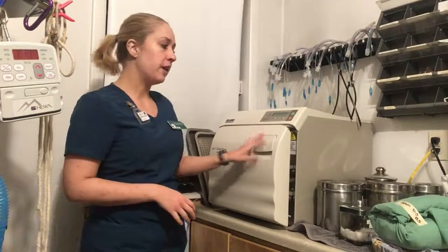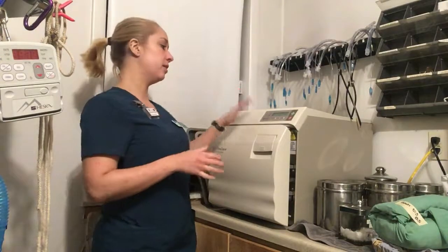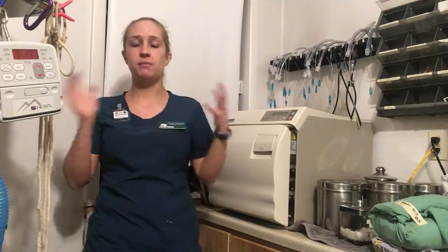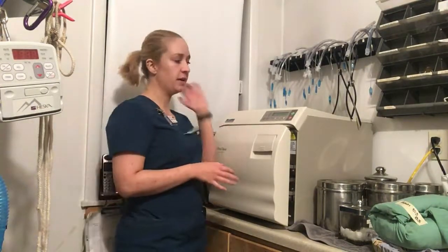So this is our autoclave. The one that we have is a gravity air displacement sterilizer, and basically what the autoclave does is it is a high pressure system that gets really, really hot, and with that high temperature and the high pressure, it kills any living thing that is on or in the packs. So it gets to about 250 to 270 degrees. It'll get up from about 15 to 27 psi, and it can take about 3 to 15 minutes to sterilize, depending on what it is that you're sterilizing.